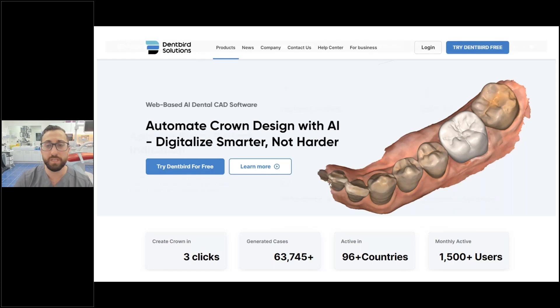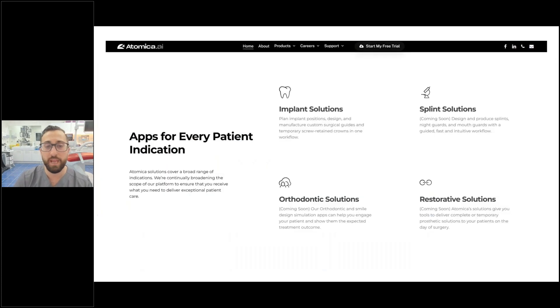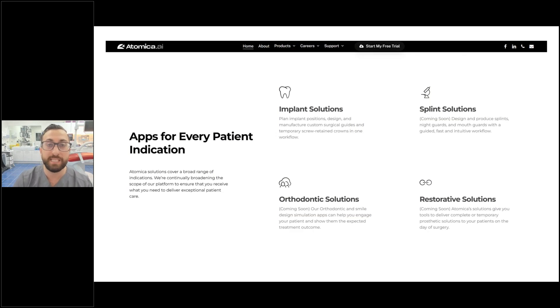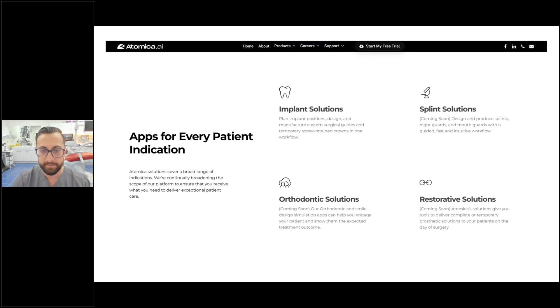Atomica AI — their website shows a web-based, basic AI design solution specifically for implant surgical guides.